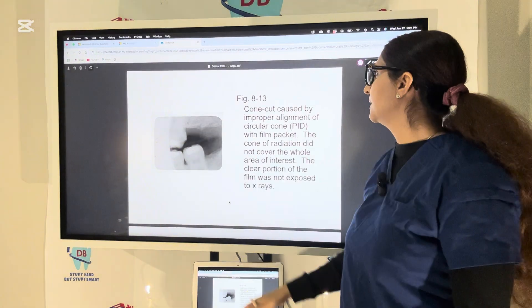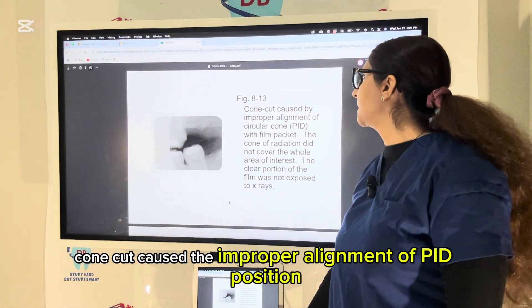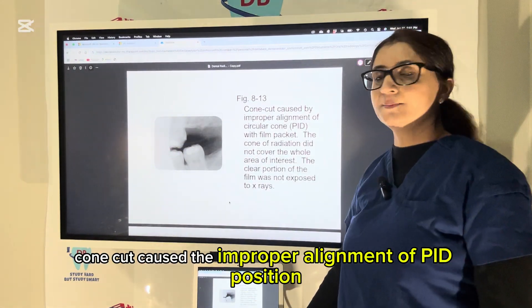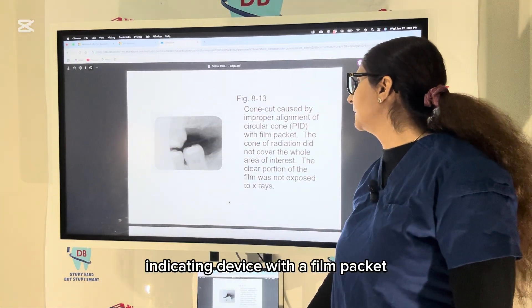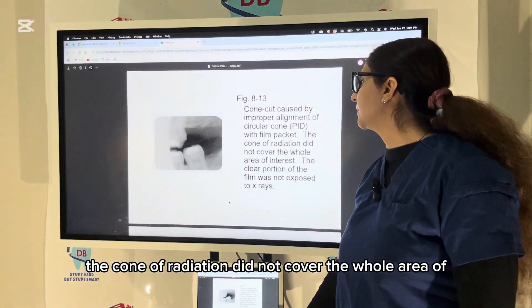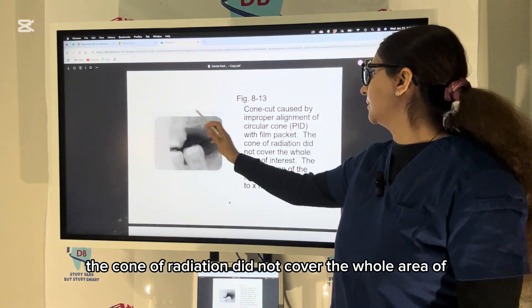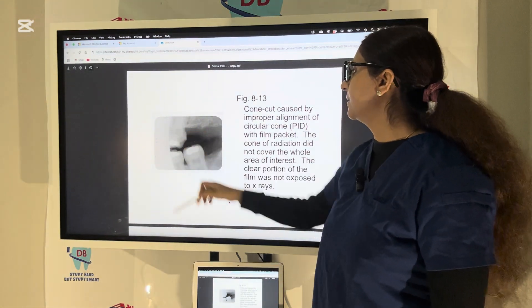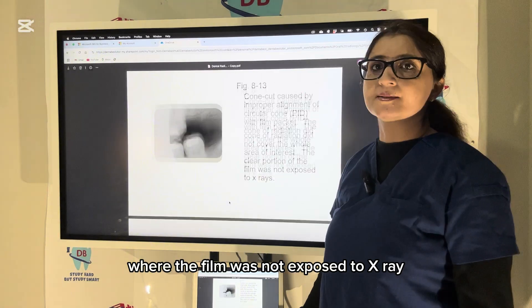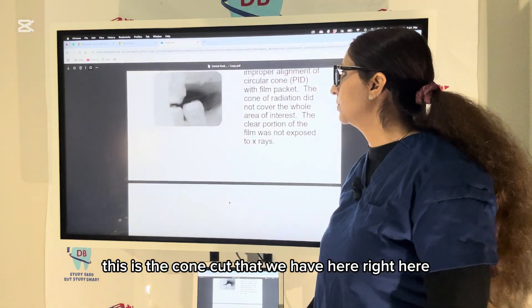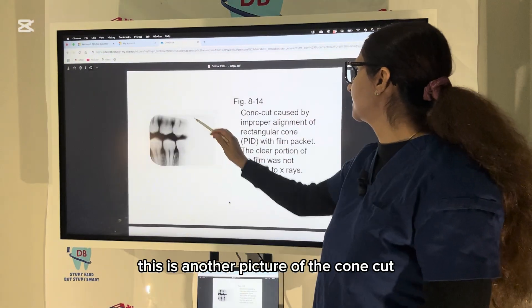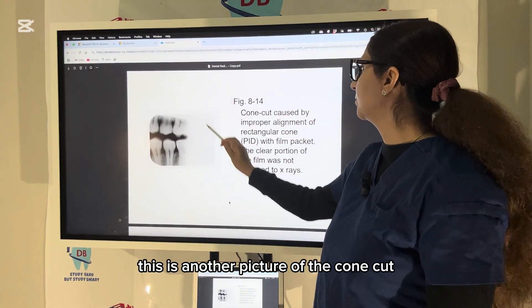Cone cut is caused by improper alignment of the position-indicating device (PID) with the film packet — the cone of radiation did not cover the whole area of interest. This is the portion where the film was not exposed to X-rays. Here is another picture of cone cut showing improper alignment of the rectangular cone PID with the film packet.